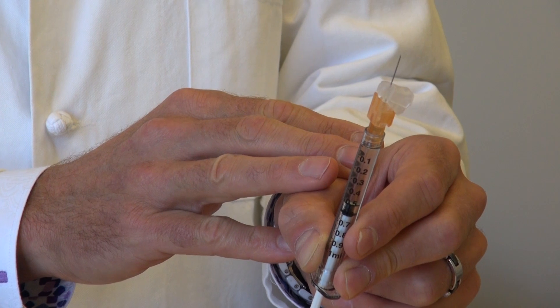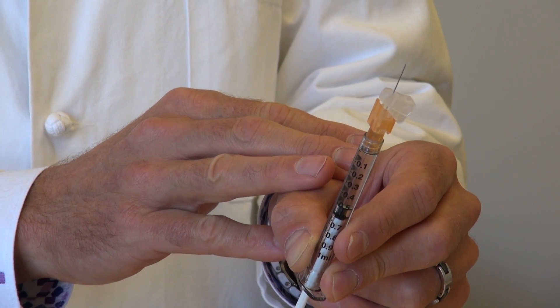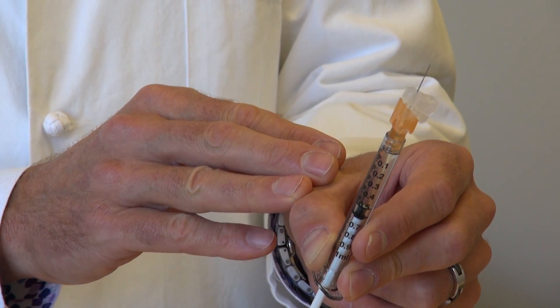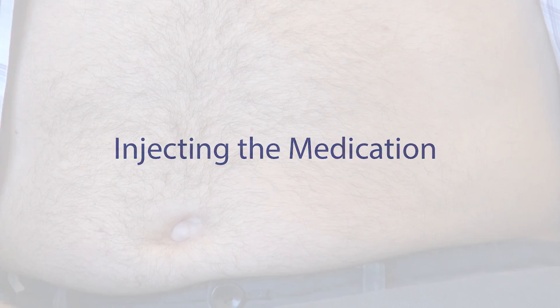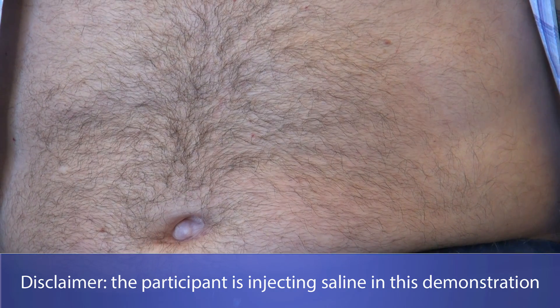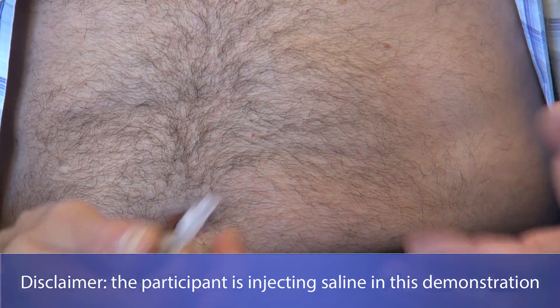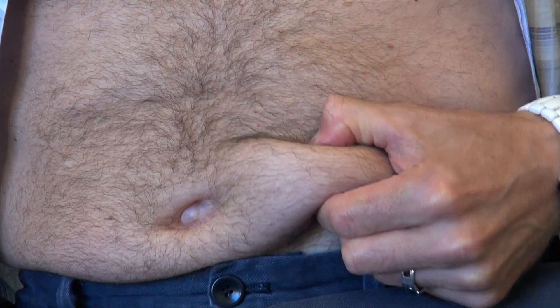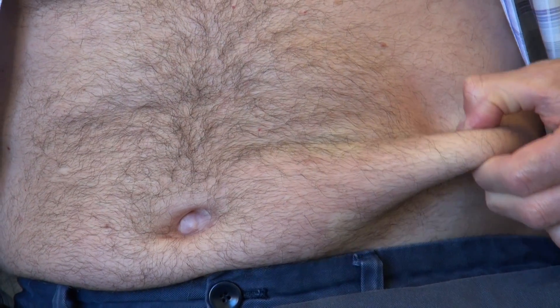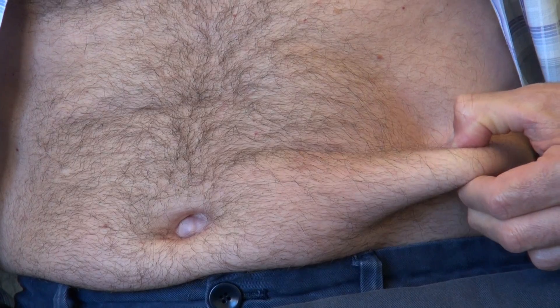The syringe is now ready for injection. You can do an injection anywhere you can pinch an inch — for instance, the abdomen has plenty of fat for an injection, while over to the side people are typically a little thinner. The love handle is also fair game. Make sure to move the injection site around, because injecting in the same place week after week will make that spot sore.